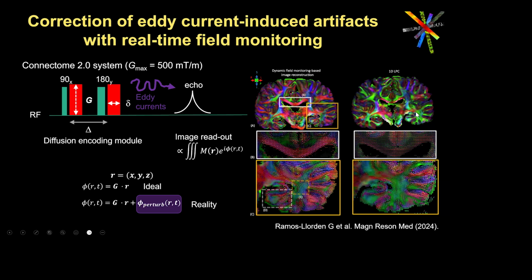The images that we obtained on the Connectome 1 scanner were usually contaminated by ghosting artifact, which would give a very strong directional bias in your FA maps, and gave rise to what one of our collaborators called the green problem with our ex vivo whole brain measurements.